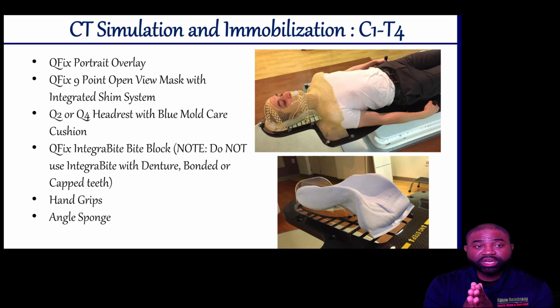And so, in order for us to irradiate the same volume with the same beam arrangement in every fraction, we need to immobilize the patient. And in order for us to be successful, we have to keep the patient as comfortable as possible. A more comfortable patient is less likely to move during treatment.